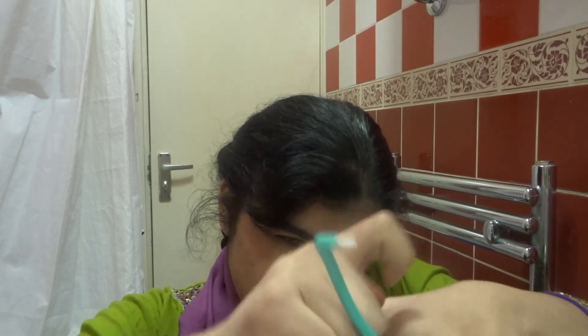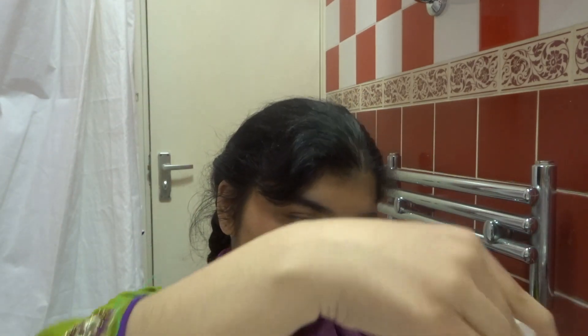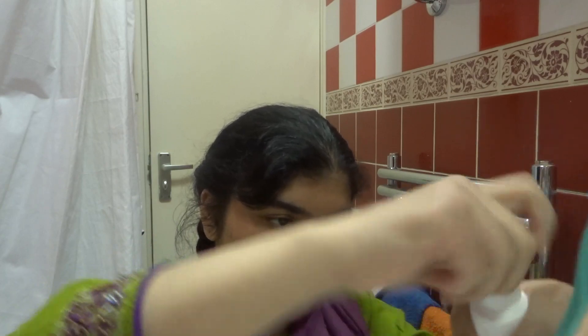Now I get this little interdental brush, put water on it, and use it in between my braces. Let me show you how it's done.